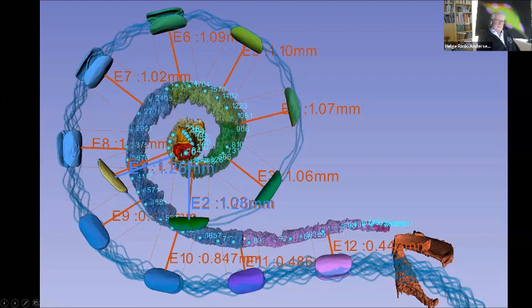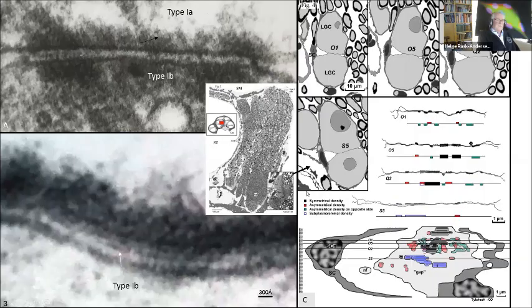You can see this area down here is the 8 kilohertz, 16 kilohertz region, where we often put electrodes, which is actually far beyond the area that we use with the cochlear implants. So the question is, should we put the electrode deeper, or should we have longer electrodes? So that's a key issue.